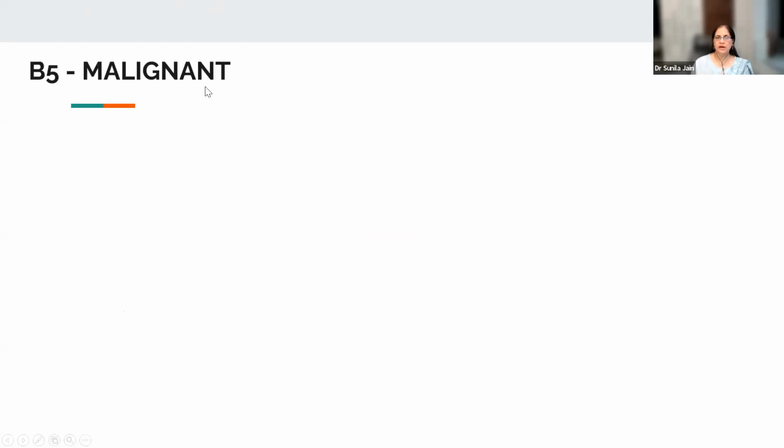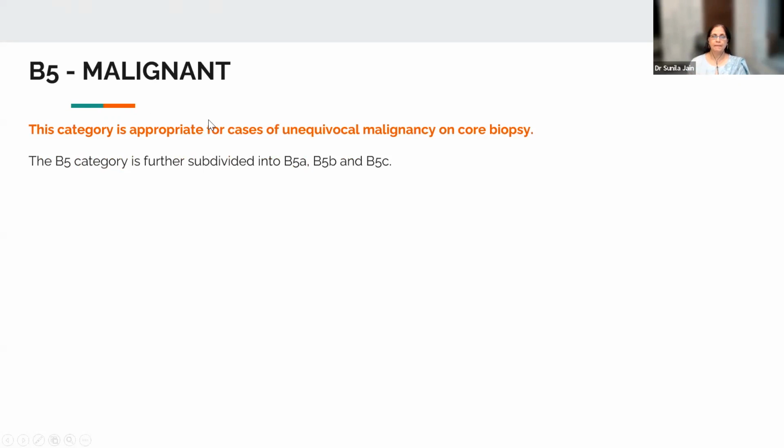Now coming to the malignant category, these are the lesions on which the treatment has to be based. This is the final word, that is, it is diagnostic. The patient can undergo treatment based on these findings. So this category is appropriate for cases of unequivocal malignancy on biopsy. It may be an in situ malignancy or it may be an invasive malignancy.